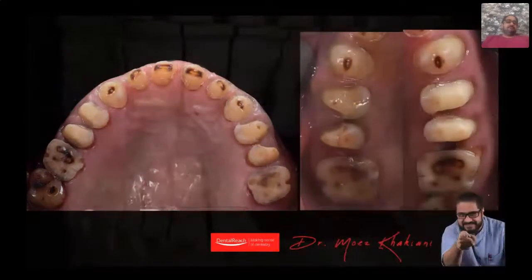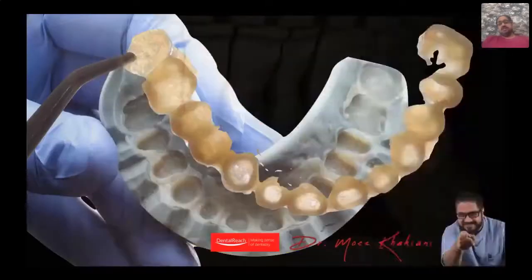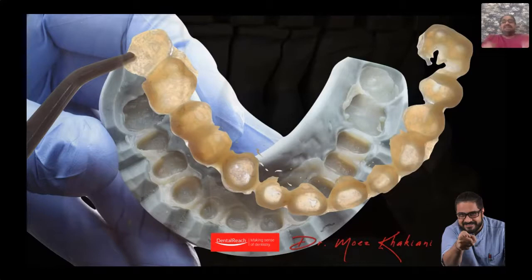Moving ahead, these are my final preps for the maxillary arch. This is just a picture showing you how thin my temporaries are, which means I have done barely any occlusal reduction. The only reduction per se that I have done is rounding everything off. Why? Because porcelain does not like anything that is sharp in the underlying substructure. So smoothing everything, rounding everything is all I have done.